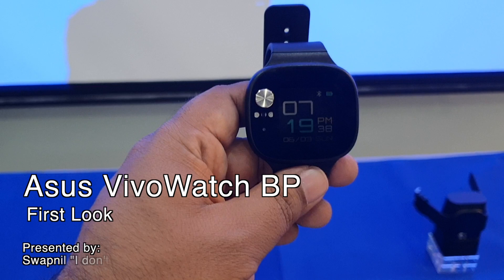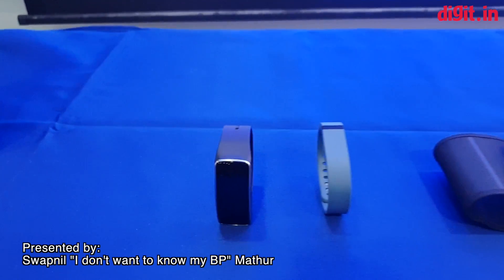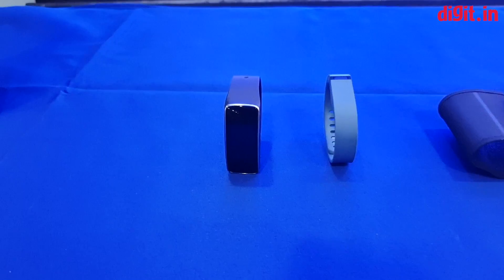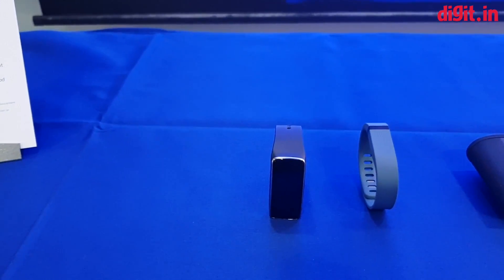Welcome to Digit.in. Today we're looking at some of the products that Asus has — though these particular ones are not Asus products. This right here is your average fitness tracker. It can measure your heart rate, tell you how many steps you've walked, the calories burned, and associated data.